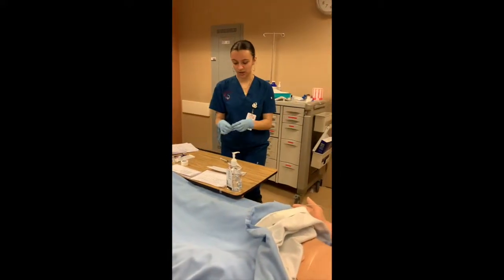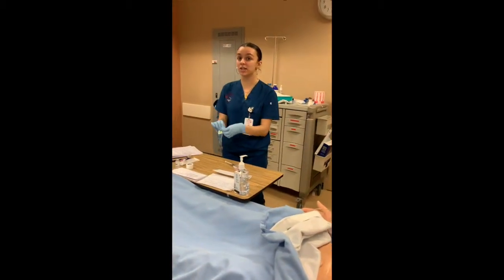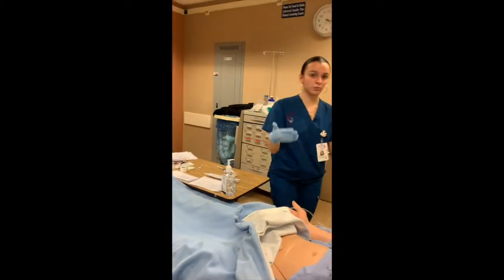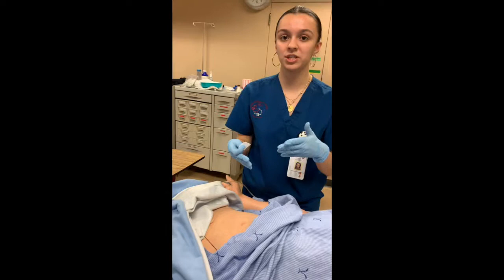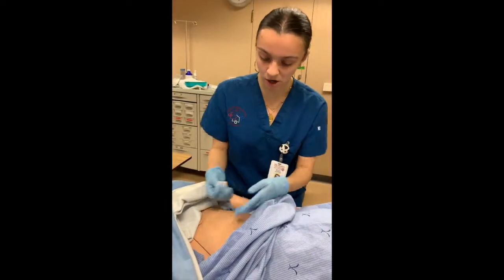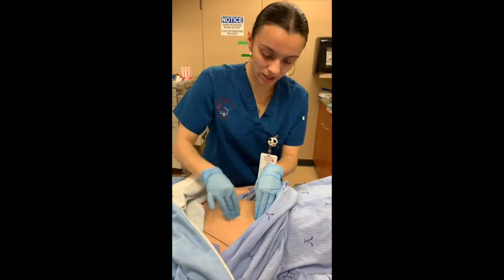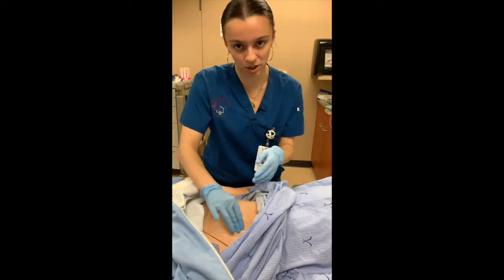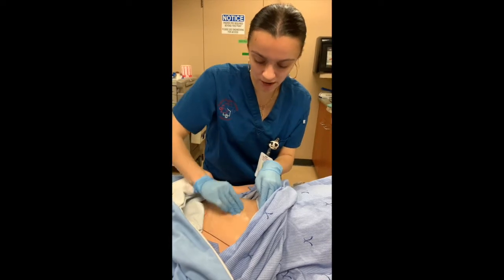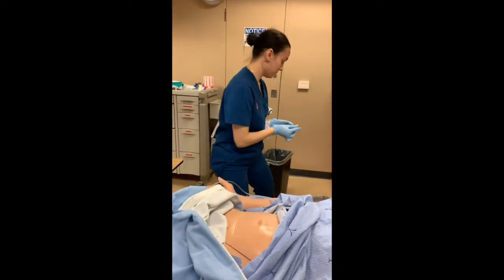So what I'm going to be doing, I'm going to be cleaning the area, and usually you would do it around 30 seconds, but just for this case, I'm just going to do just a nice clean. But in a real clinical setting, you would do it for approximately 30 seconds just to ensure the site is clean. So I'm just going to be doing it on just this side of the abdomen because it is the fattier area for a subcutaneous. So I'm just going to wipe it down for approximately 30 seconds. In a real clinical setting you would. So as I'm wiping it down, okay, so I'm just going to discard the alcohol wipe.